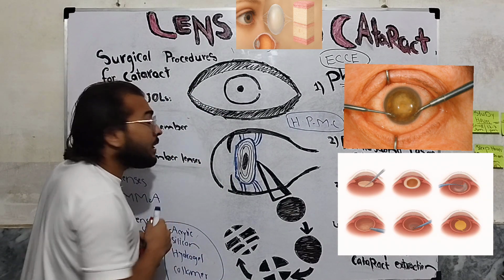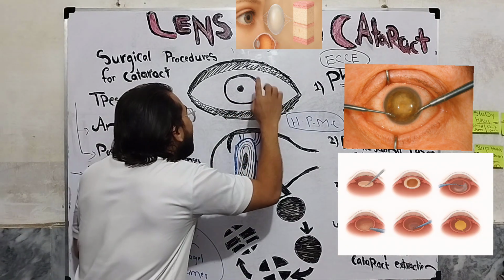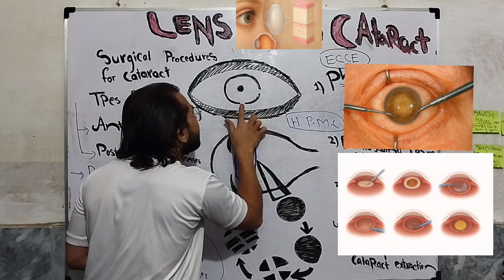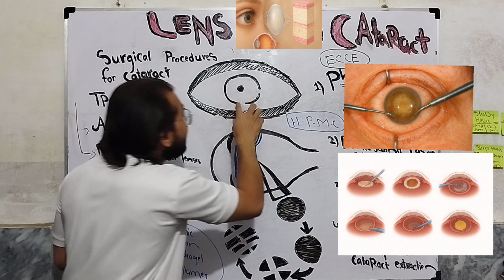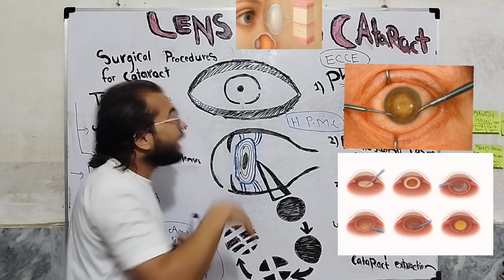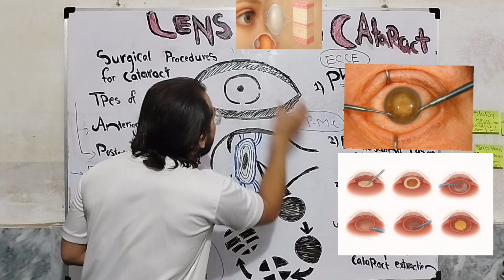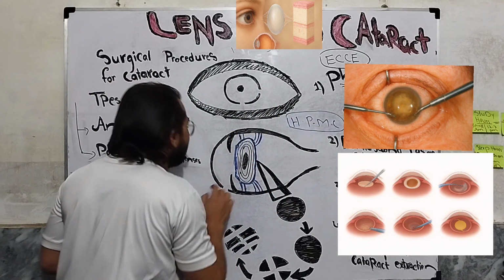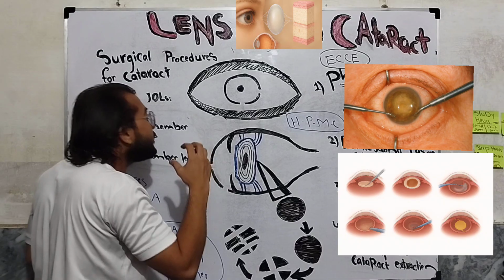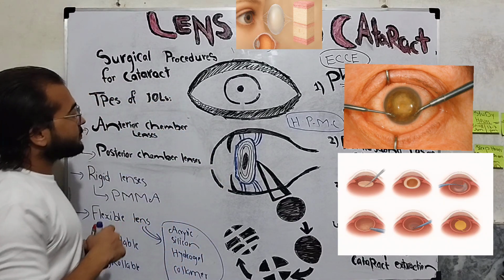Now we will make a second incision. The second incision we make at a right angle to the first one. The purpose is to balance the hydrodynamics and for instrumentation. So after the viscoelastic, we make a second incision into the cornea for the hydrodynamics and the fluid balance.